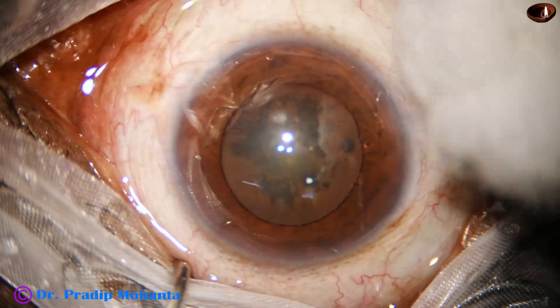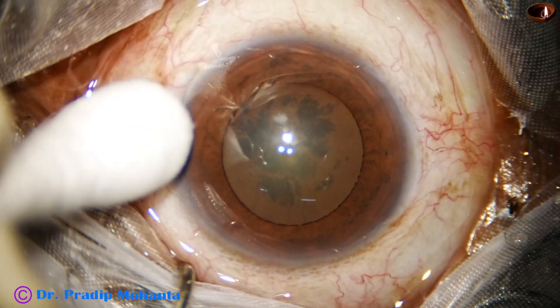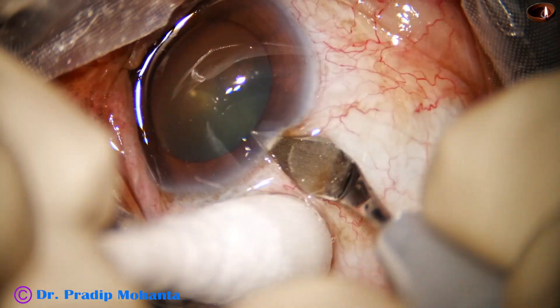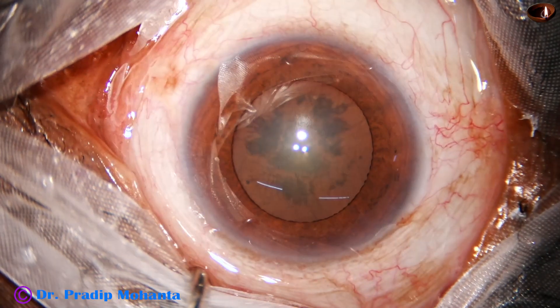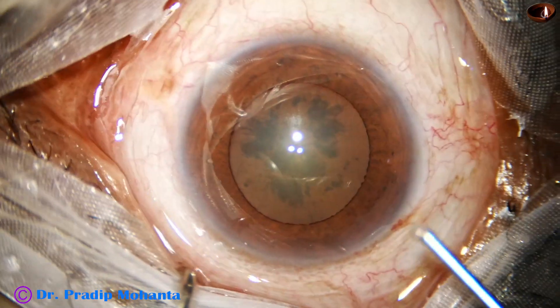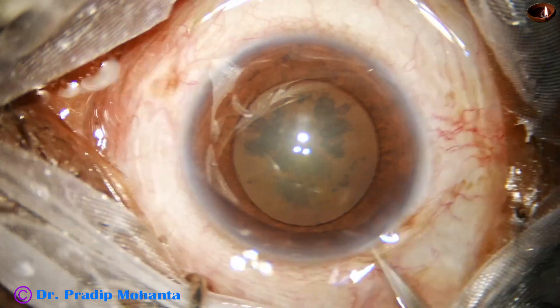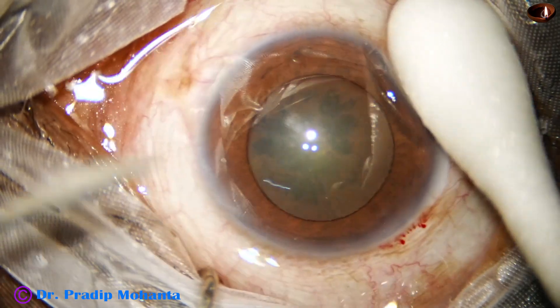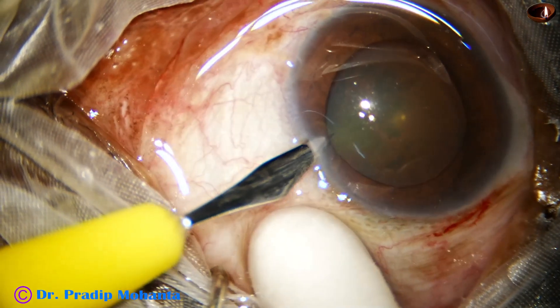And now the main incision is planned. This is the main incision with a 2.8 millimeter steel keratome. And now 2% hydroxypropyl methyl cellulose is used to fill the anterior chamber. A side port is then made on the left side of the main incision, about 90 degrees away.